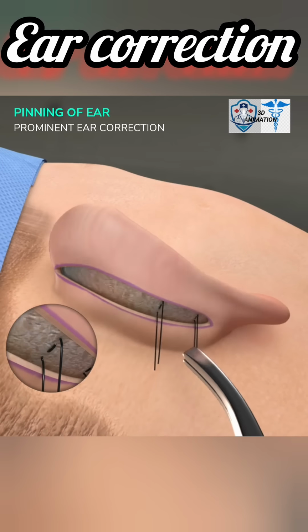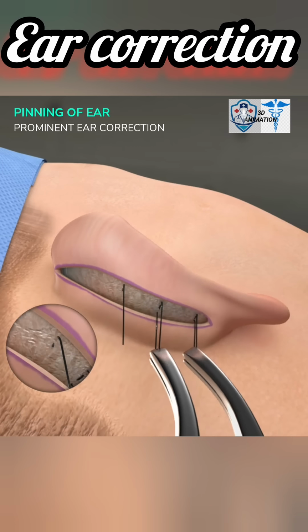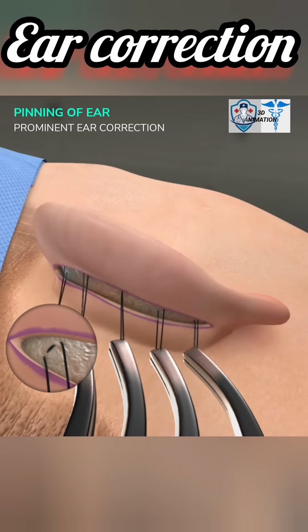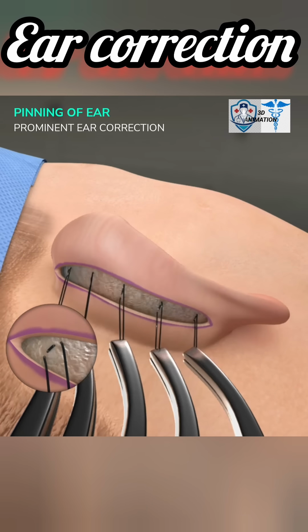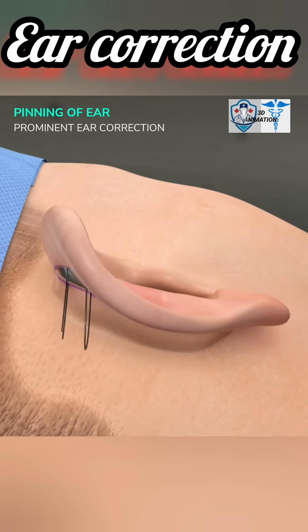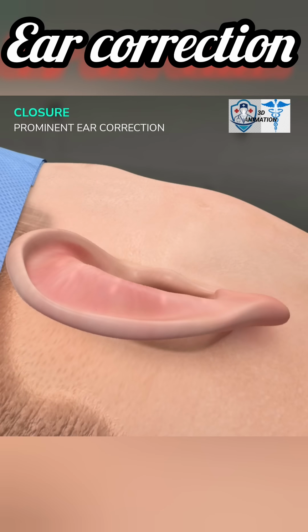Perform this process to insert 4 more stitches extending from the lower part of the incision, proceeding superiorly. In short, you carefully test the effect of each individual stitch on the ear prominence. Once you have completed the 5th stitch and are happy with the effect of each on the ear prominence, remove the clips from all stitches and tie down each stitch.